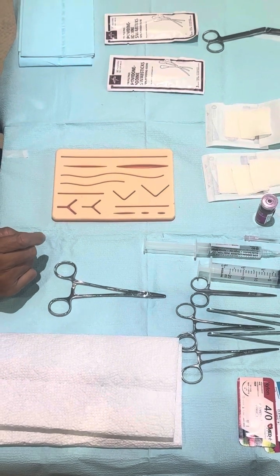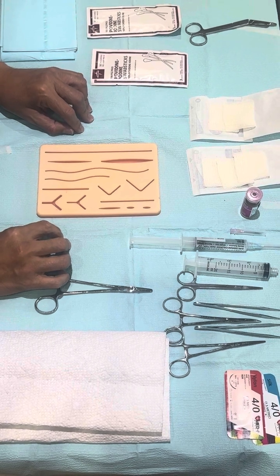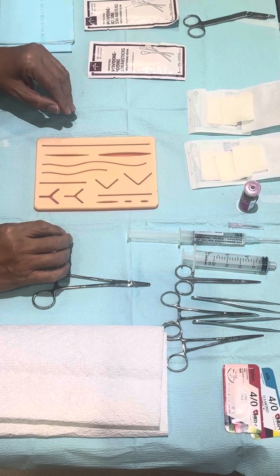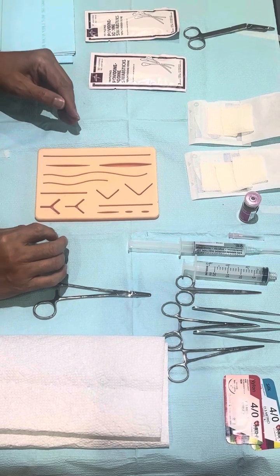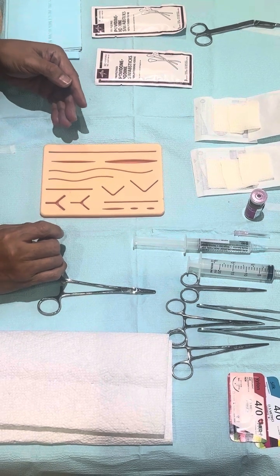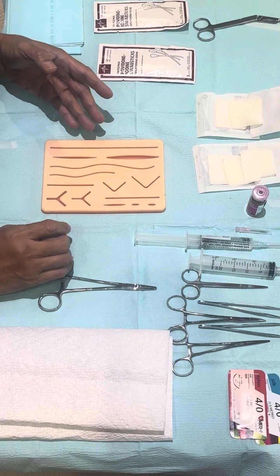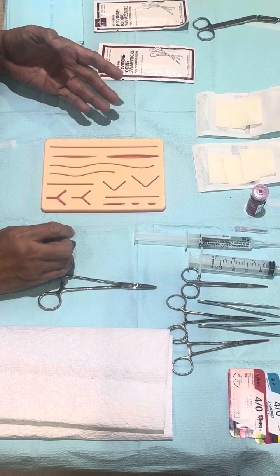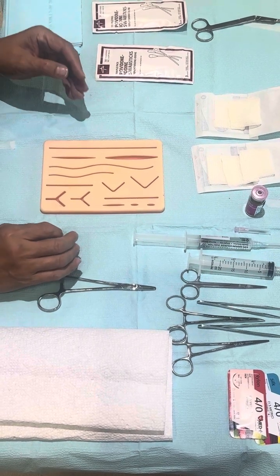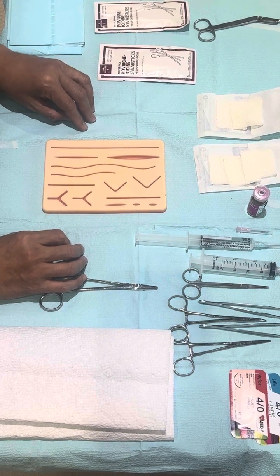I'm here to demonstrate suturing of a wound, and before we proceed, we have to inform our patient about our assessment of the wound. For example, this is a lacerated wound. Discuss with the patient all the indications, contraindications, risks, and benefits of the procedure, and also get informed consent from the patient.